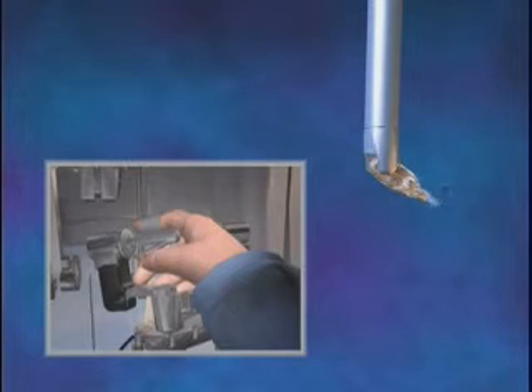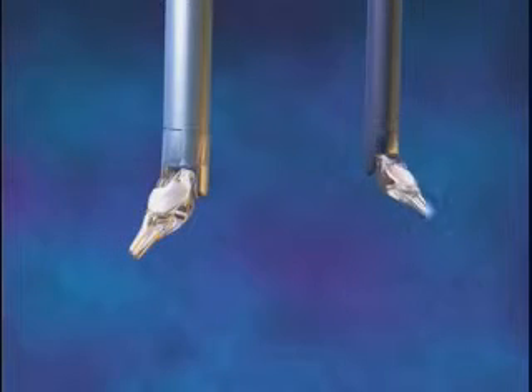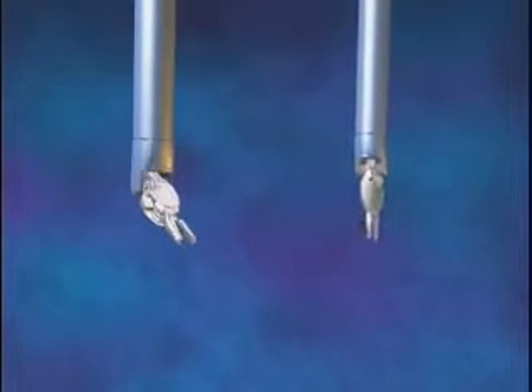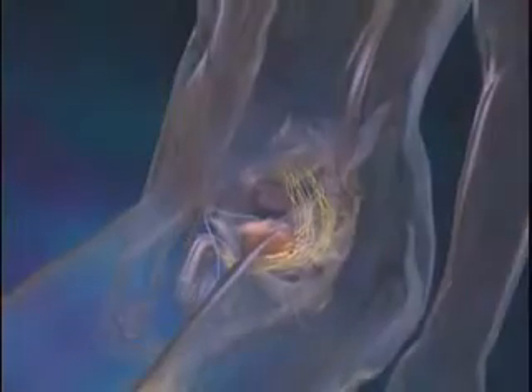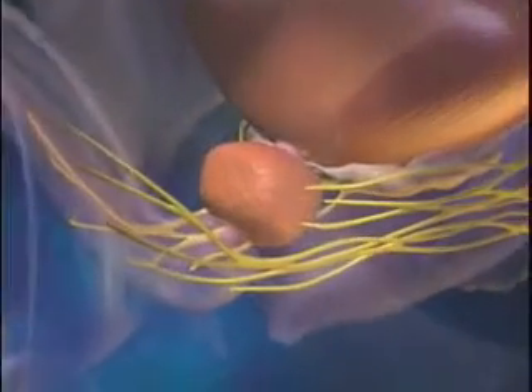Unlike standard laparoscopic instruments, the specialized DaVinci instruments can articulate and rotate 360 degrees with unparalleled precision and flexibility. The camera of the system provides the surgeon with a remarkably clear, three-dimensional view inside the body.